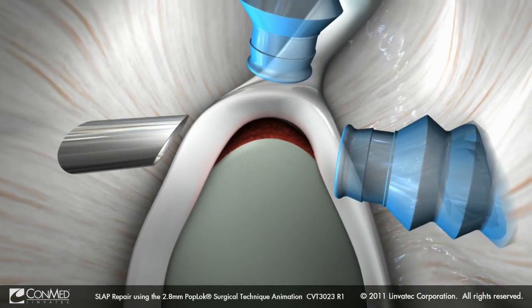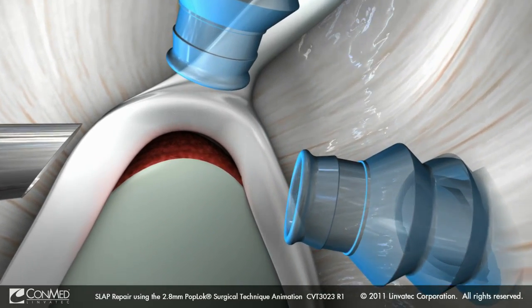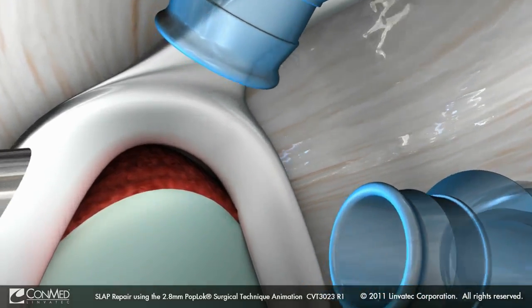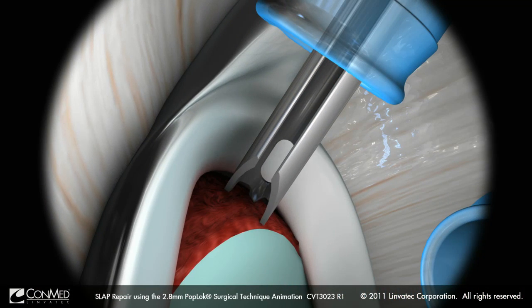After the superior glenoid tubercle is prepared using the Liberator Plus shaver blade, the pop-lock drill guide is placed on the debrided bone at the midpoint of the biceps anchor. A pilot hole is created with the pop-lock drill bit.